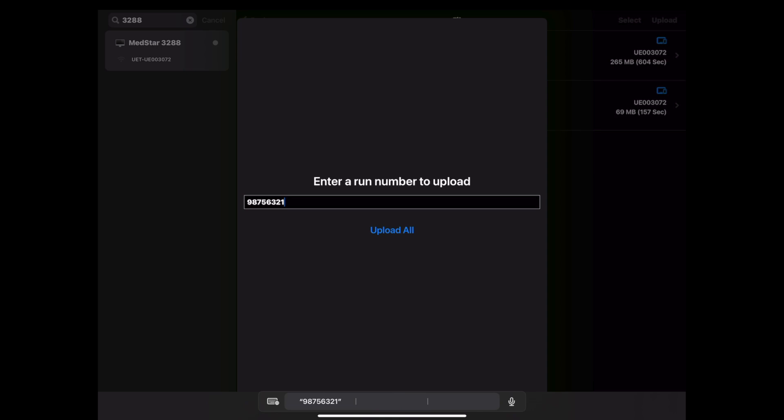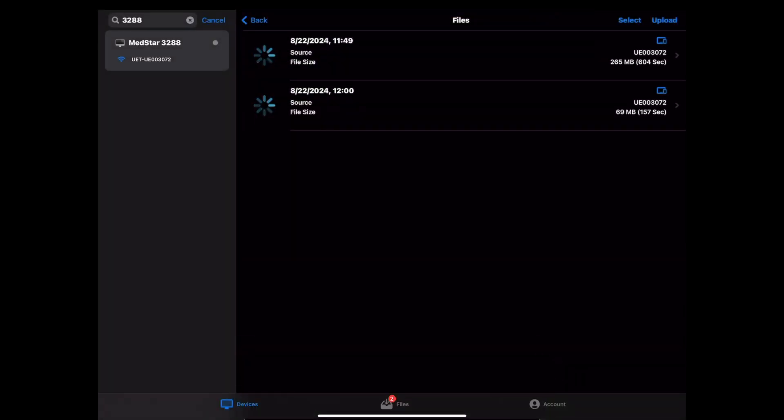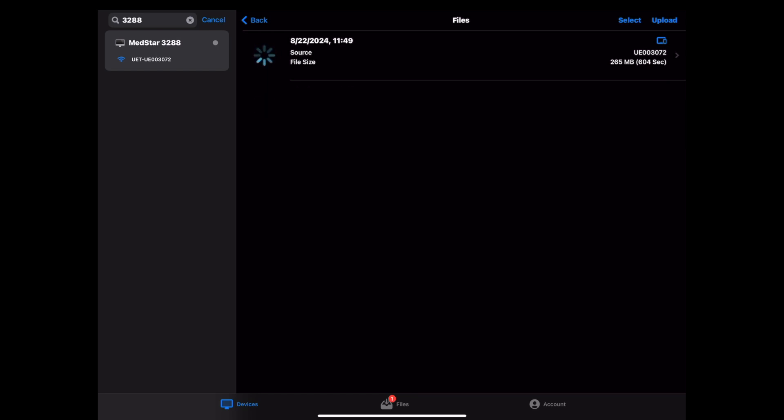After entering the response number, you will click upload files and this will begin the upload process to the DeepVin cloud. As the file or files are uploading, they will have a spinning icon over them and the file will disappear once successfully uploaded. Please be patient here as this may take some time. For a 10 minute video or basically when the device timed out, this may take about 3-5 minutes based on our prior field testing.